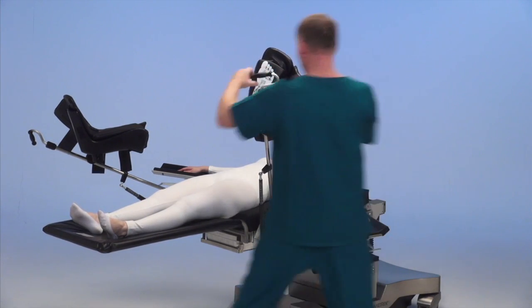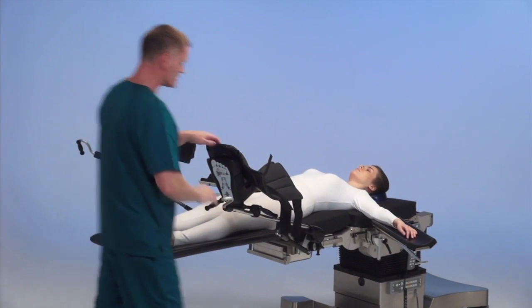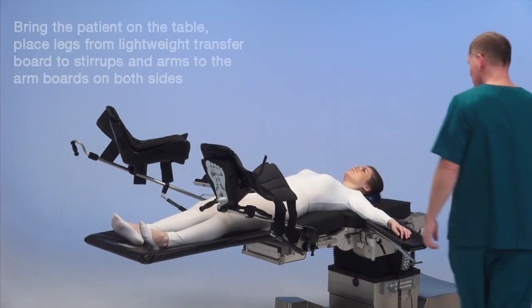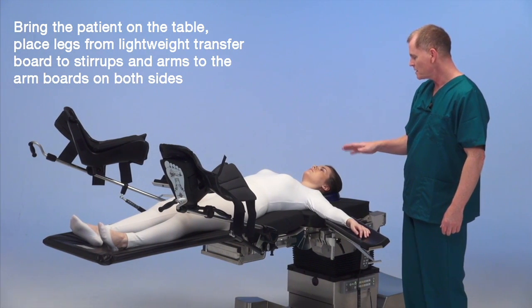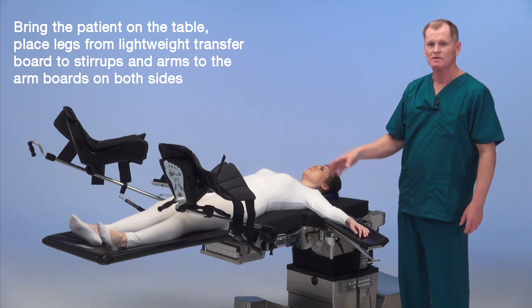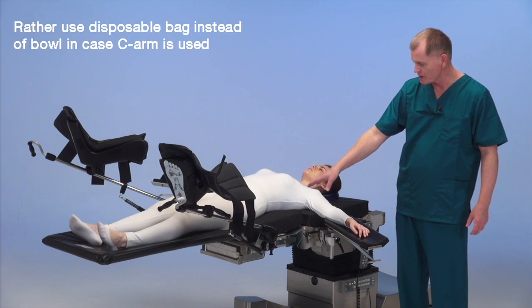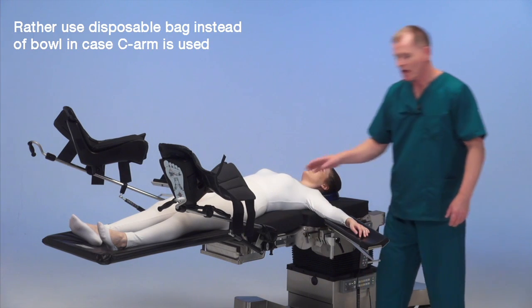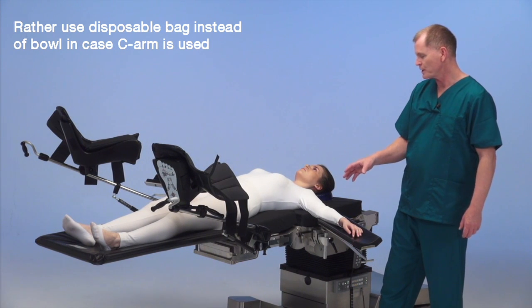We're going to place the legs into the stirrups for lithotomy position. A couple of good questions to ask the surgeon: will they be using a C-arm for the case? Does he sit or stand? Does he want a hard pan, which we've installed underneath the seat plate, and/or a disposable bag — we have both.